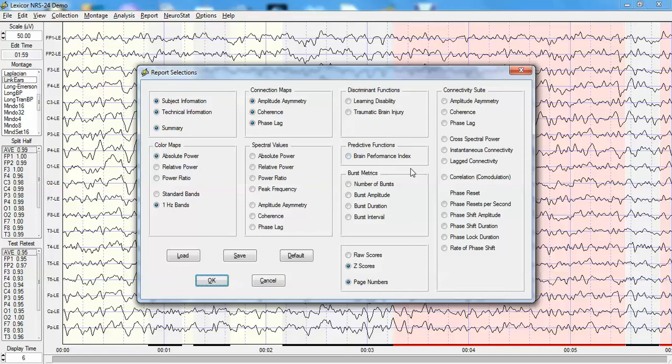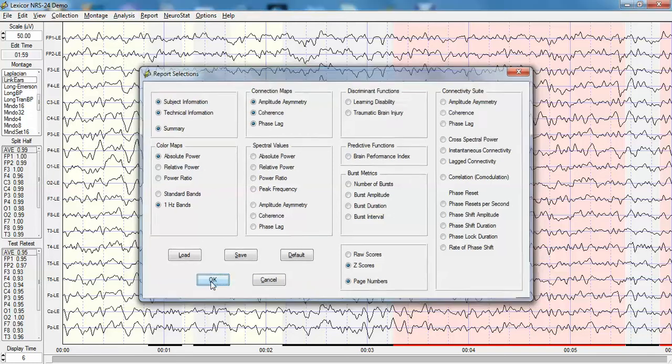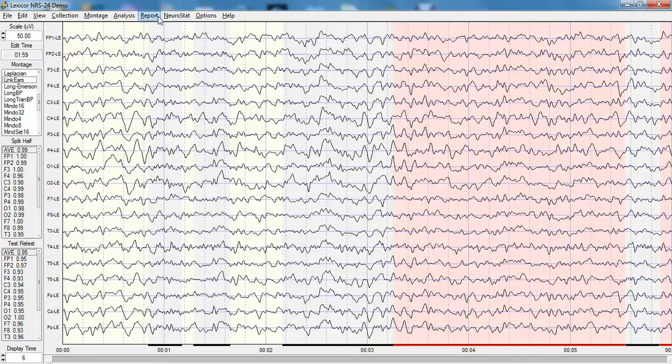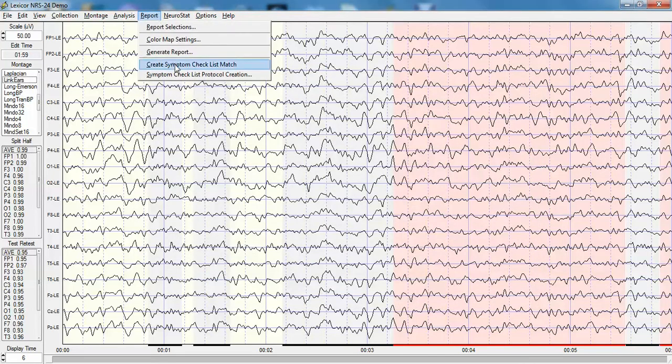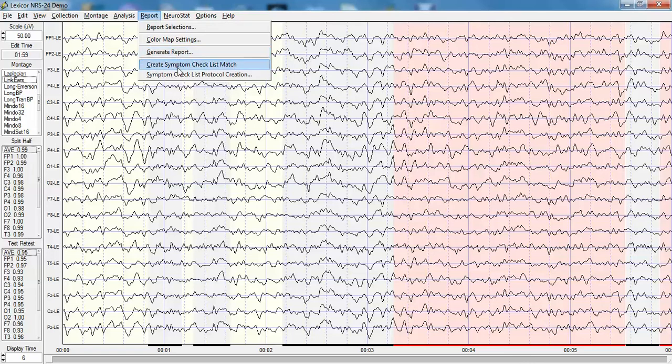There are also discriminant functions and estimates of prediction on neuropsychological tests. Then one can click and generate a report as well as generate symptom checklist match that allows one to evaluate the status of a patient's brain and then use that information to perform biofeedback.